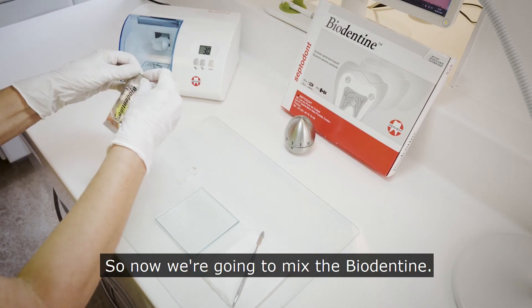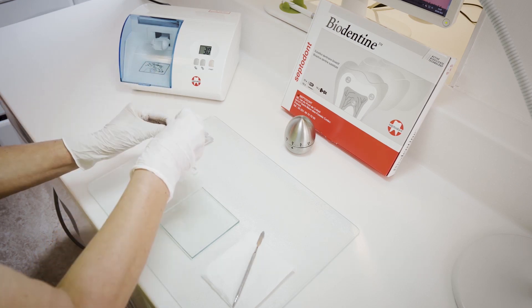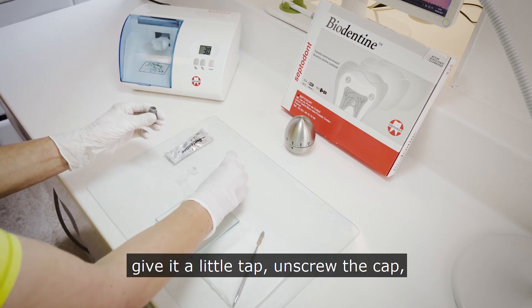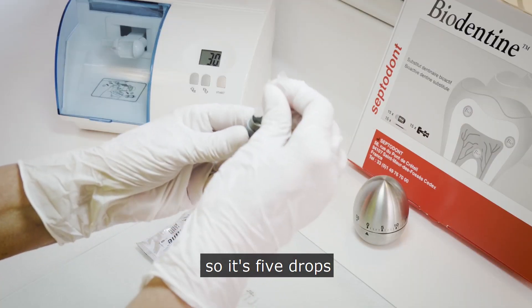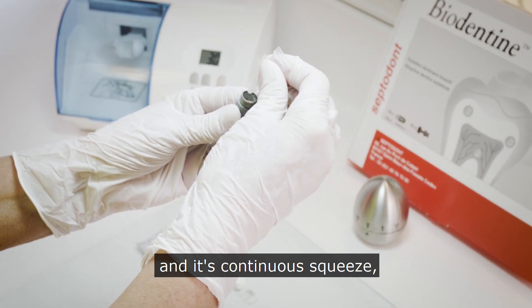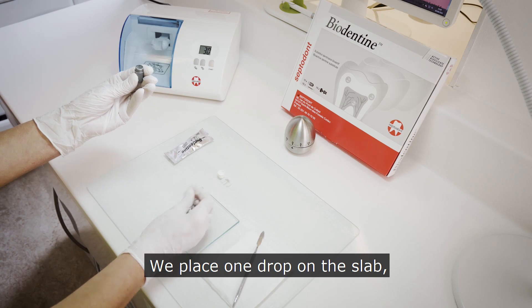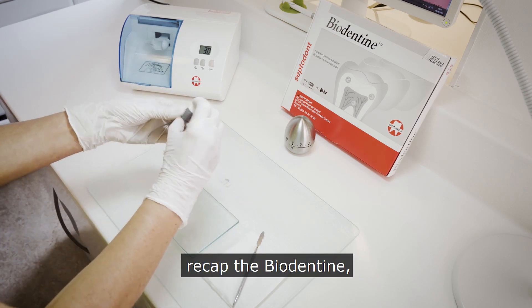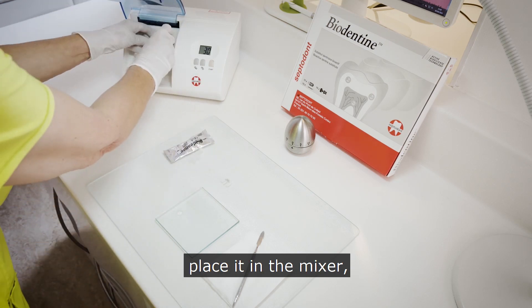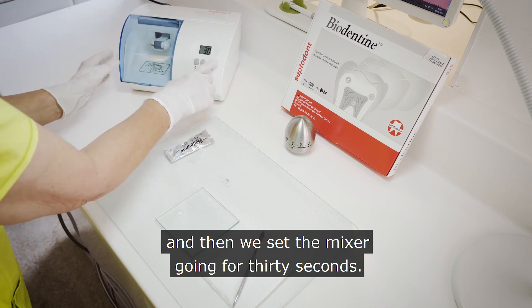Now we're going to mix the biodentine. We take it out of its pack, give it a little tap, and unscrew the cap. We then add the drops — it's five drops and it's a continuous squeeze, not releasing between drops. We place one drop on the slab, recap the capsule, place it in the mixer, and set the mixer going for 30 seconds.